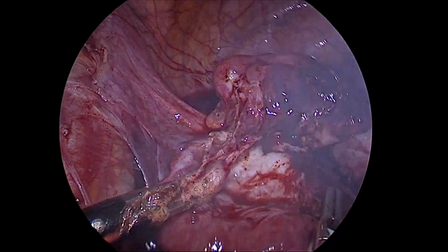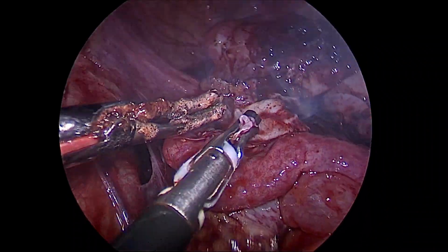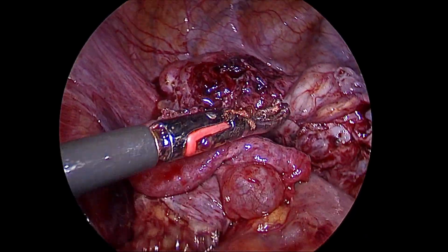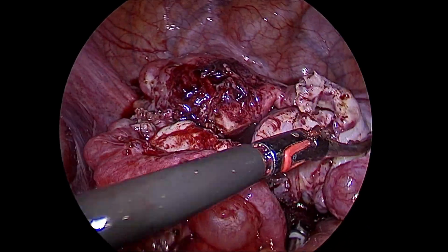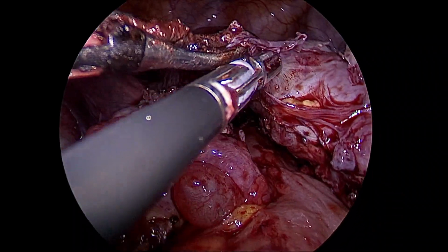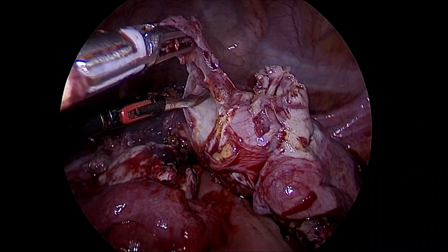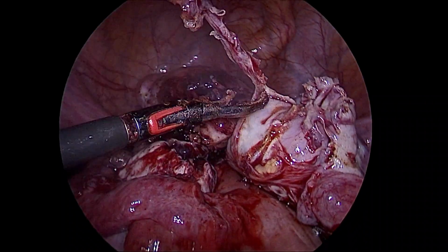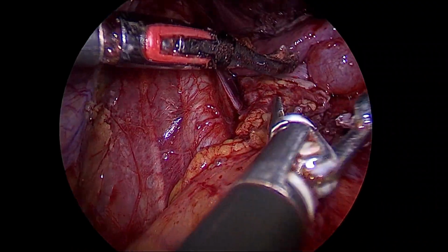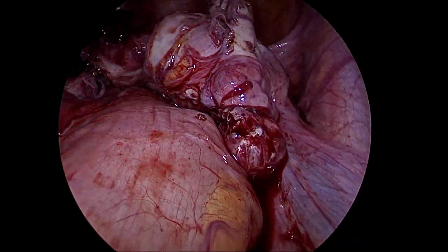And all these cystic structures, we try to remove that from the POD, from the surface of the uterus, from the tubo-ovarian masses. Now, as you can see, we are restoring the tubo-ovarian relationship, the tubal anatomy on the right side as well. Here again there were the peritoneal coverings, so that has been removed, thereby ensuring that the ovarian surface remains clean and normal, so that when she actually has an ovulation, the egg has a higher chance to go into the fallopian tube.